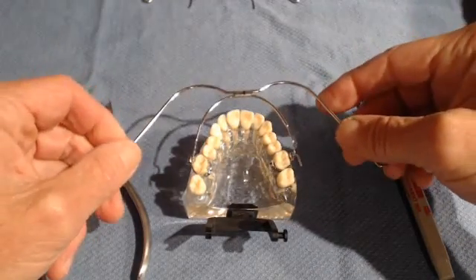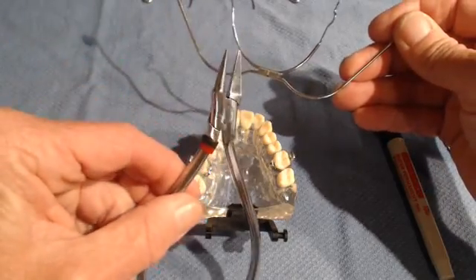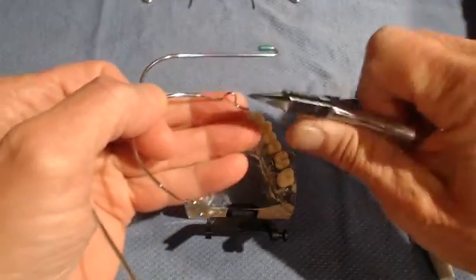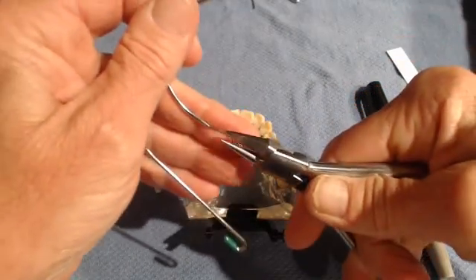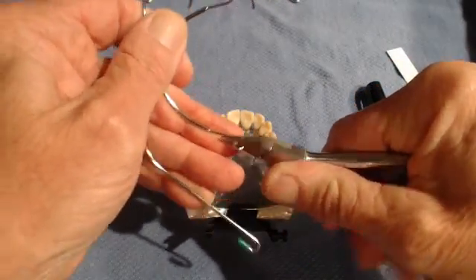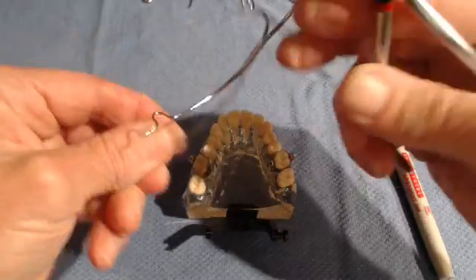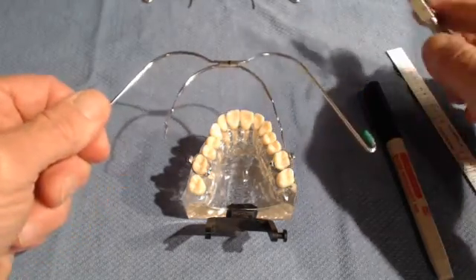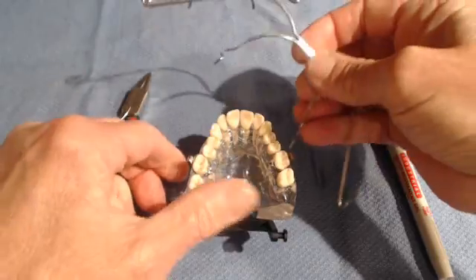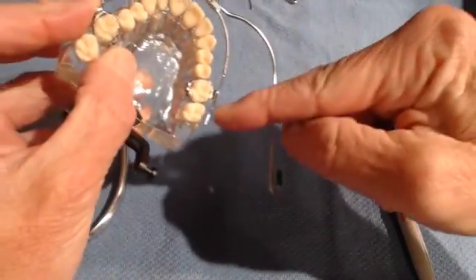After you remove it from the package, the first thing I like to do is use the light wire plier to bend the U-loops out at about 15 to 20 degrees. This is not measured by anything — it's just a random outward bend. You can see them pointing outward now; this will clear any brackets that you have on the upper second bicuspids. I normally do this on every delivery.